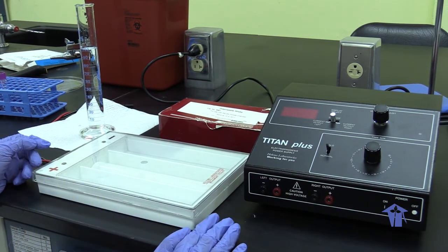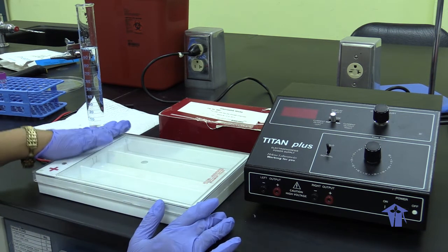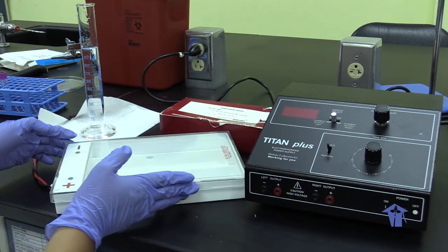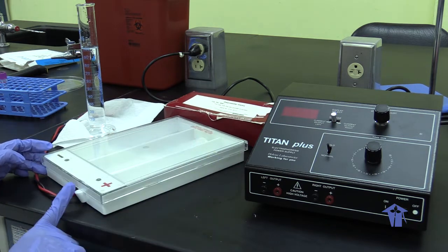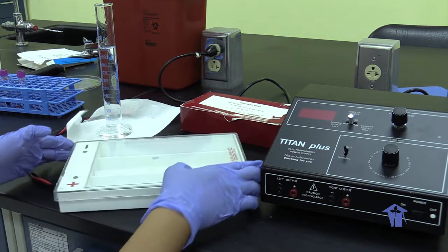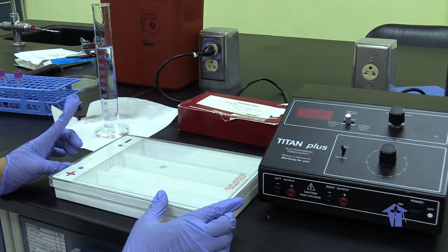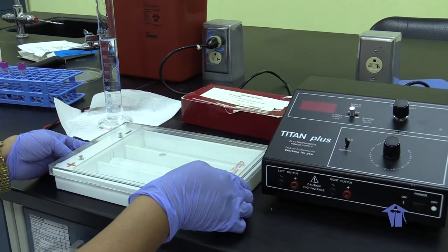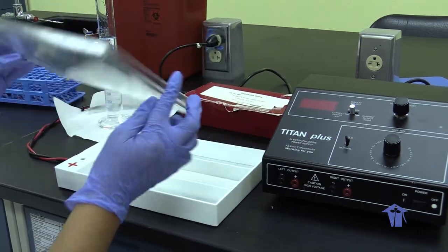One of the things I want to emphasize is the actual removal of the cover. The manufacturers place something here, and that's where you're going to put your thumb, and your index finger goes underneath. Able to remove.